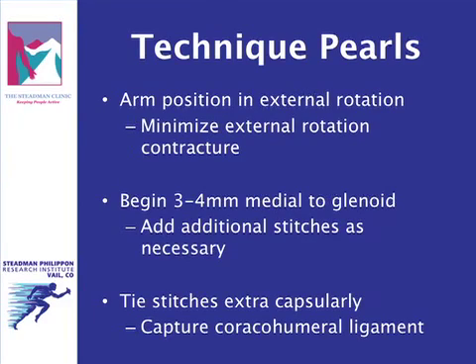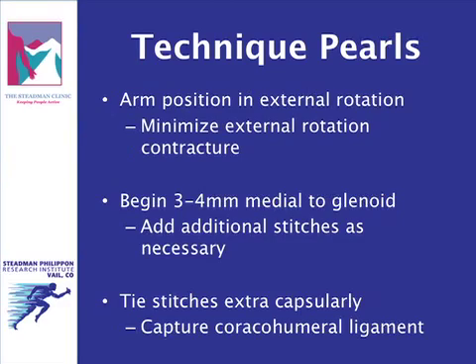If closure is performed, several tips may help maximize its efficacy. As described by Garzman and others, tensioning the closure in 30 degrees of external rotation should minimize external rotation contractures. In addition, placing the medial stitch 3–4 mm from the glenoid and tying each stitch extracapsularly helps to capture the maximal amount of tissue, making the closure as robust as possible. Additional stitches may also be placed more laterally as necessary to achieve the desired closure magnitude.